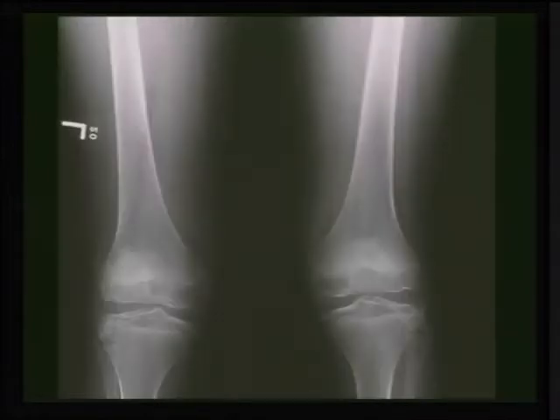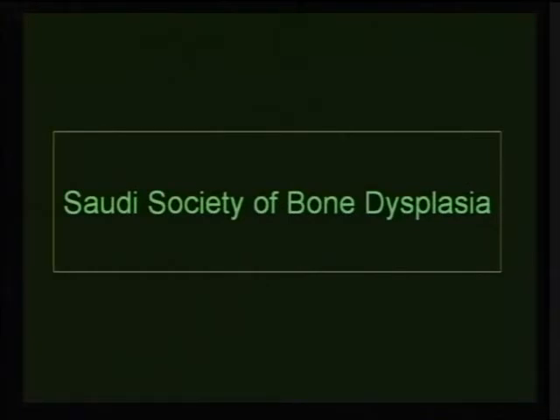If we have an epiphysis which is flattened, deformed, and abnormal in shape, this could be multiple epiphyseal dysplasia, and when the children are grown it is still small and flattened, and they can develop degenerative changes very easily. So we actually need to learn our radiology well.